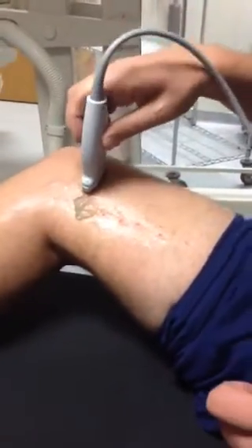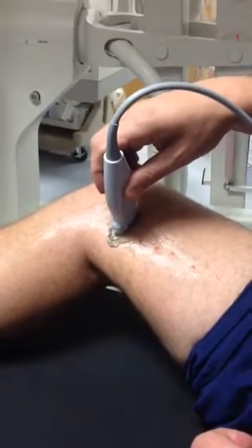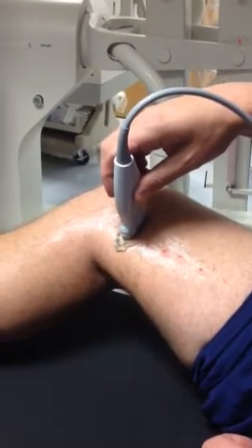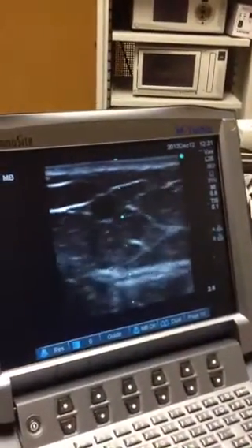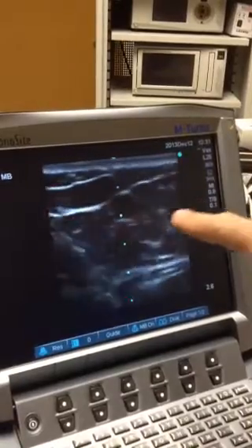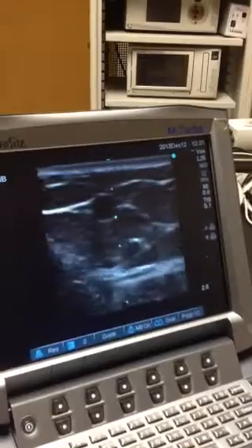Put a little gel on the leg as well as on the probe. You're going to start a little high, straight up and down, perpendicular to your leg, and just slowly slide down watching the screen. Starting high, you slowly slide down until you locate the vein, which is right now in the center of the screen. That's your greater saphenous vein.